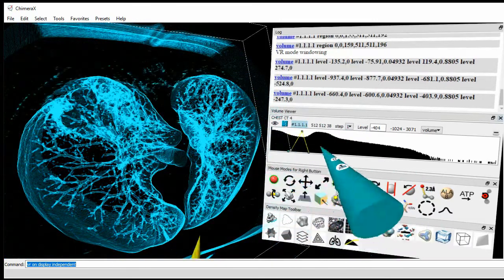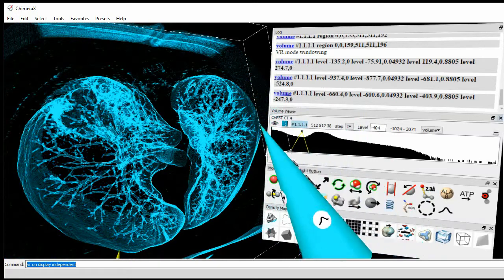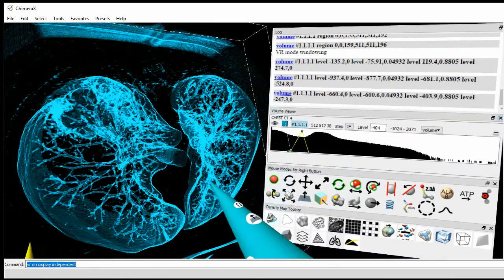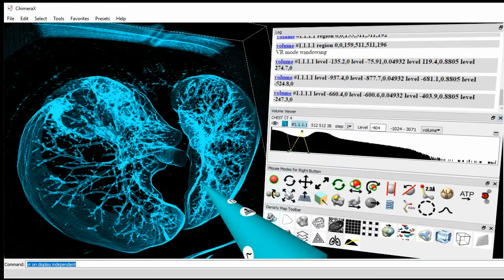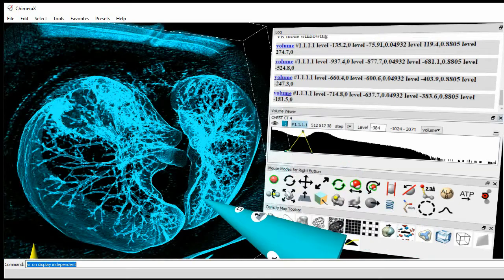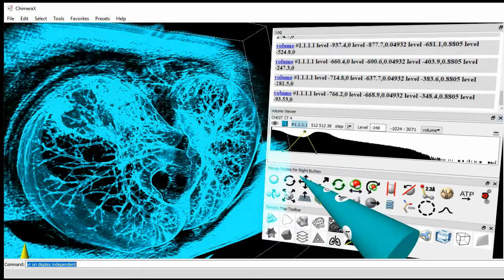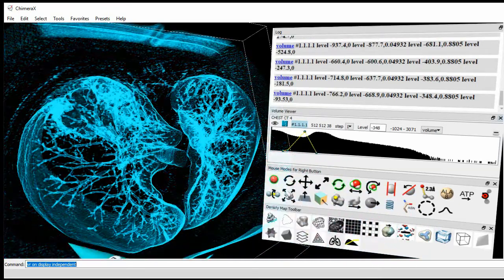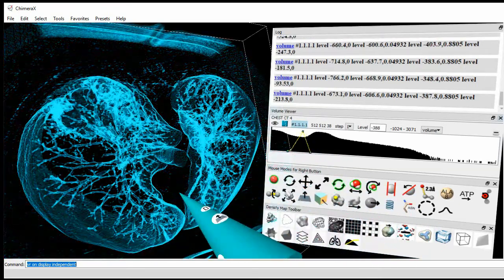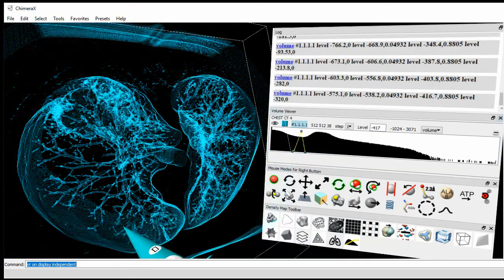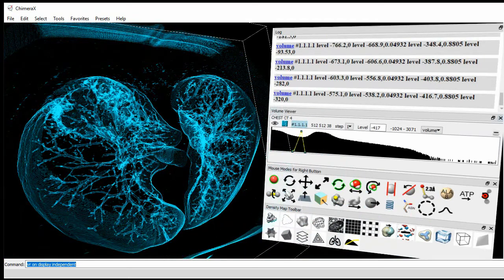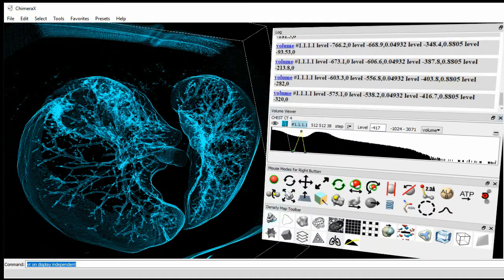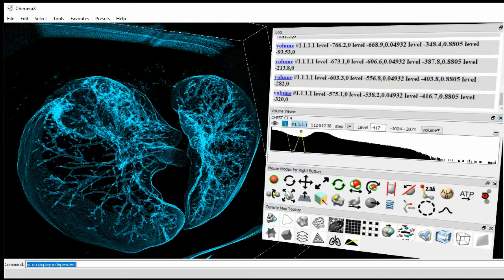Another thing I can do that's common with medical imaging is windowing and leveling. There's a mode here. It's this little bump curve. I'm going to click on it with the grip button on the side of the controller. It can do two things. It can either move this yellow curve to the right or to the left. I do that by pressing the button and drag up. It moves the curve to the right. Drag down, it moves it to the left. Or I can change the width of the curve. I drag horizontally. If I drag horizontally to the right, it makes the curve wider. Horizontally to the left makes the curve sharper, narrower. That's a basic introduction to how to look at the data, crop the data, slice through it, and color the data in VR.